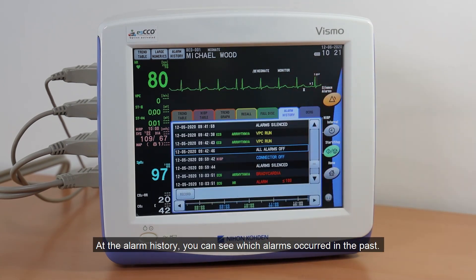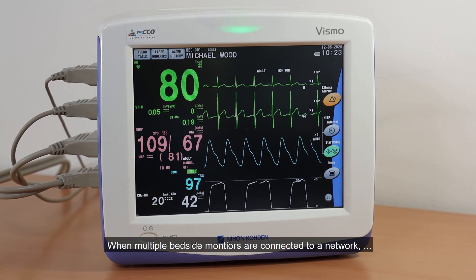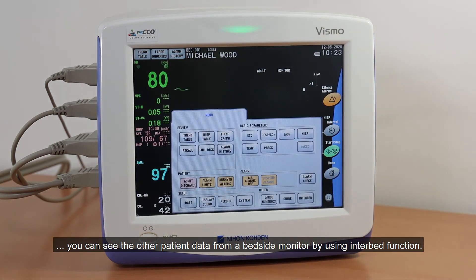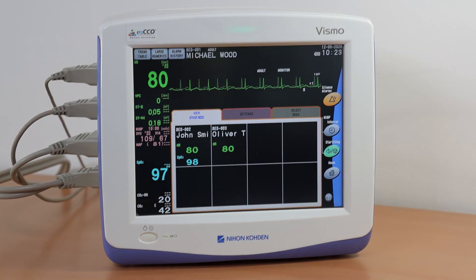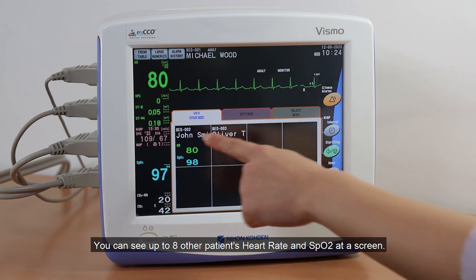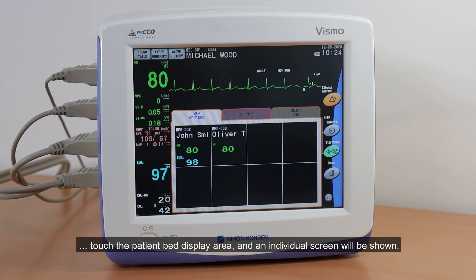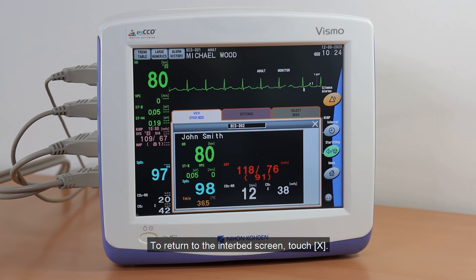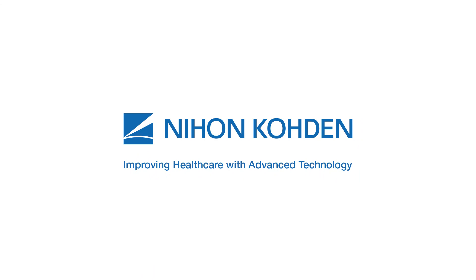At the Alarm History, you can see which alarms occurred in the past. When multiple bedside monitors are connected to a network, you can see other patient data from a bedside monitor by using the Interbed function. You can see monitoring data and other alarms as well. You can see up to 8 other patients' heart rate and SpO2 on one screen. When you would like to see more parameters, touch the patient bed display area and an individual screen will be shown. To return to the Interbed screen, touch X.